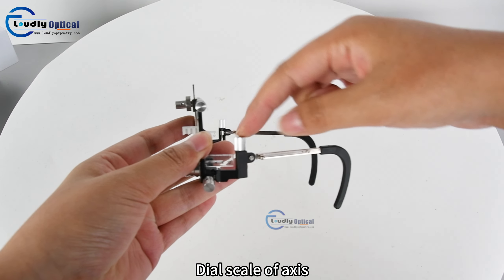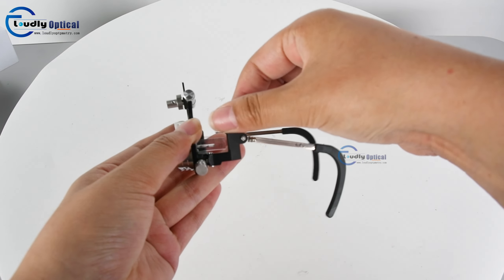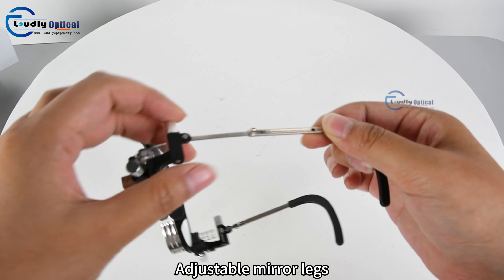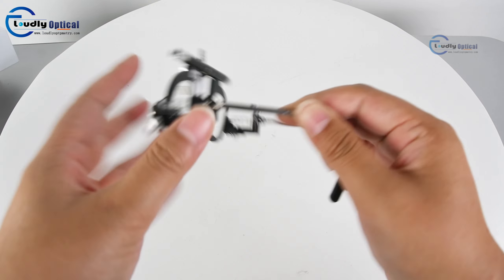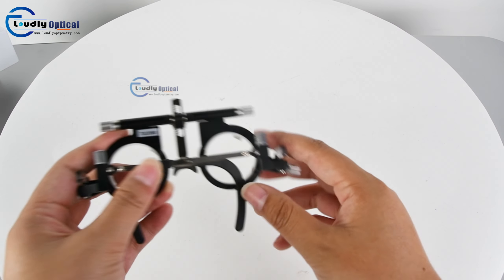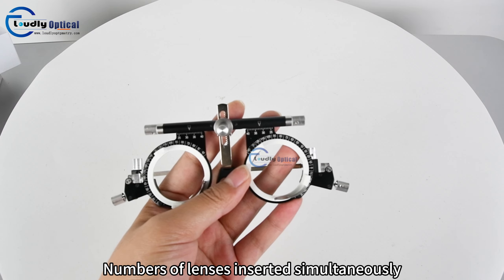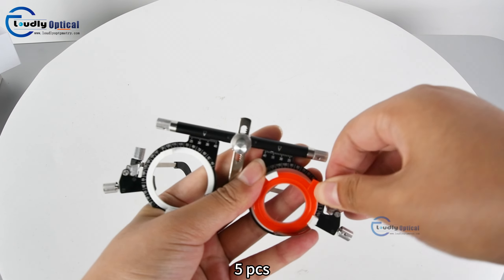Dial scale of axis here. Adjustable mirror legs here. Number of lenses inserted simultaneously in the left or right holder: 5 pcs.